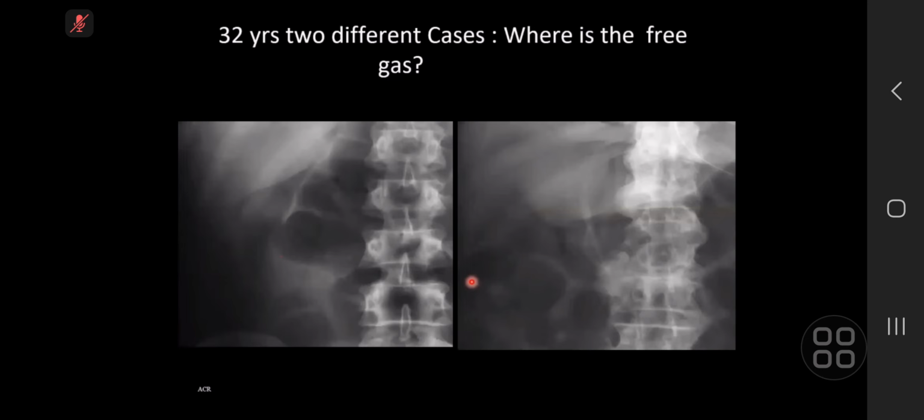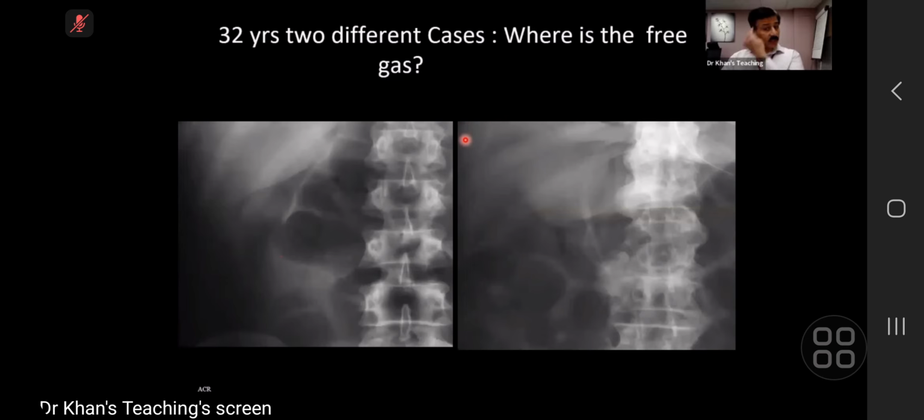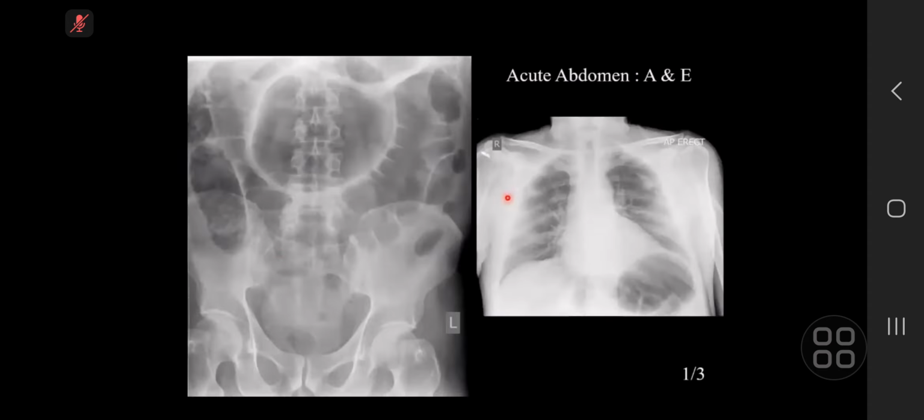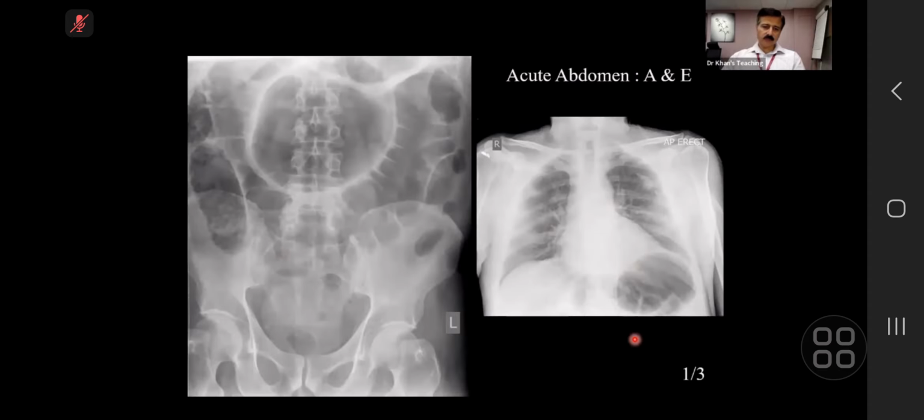So I have clicked you, and I hope it's worked for you. Are you with us, candidate 6? Yeah. Okay. This is my favorite film.